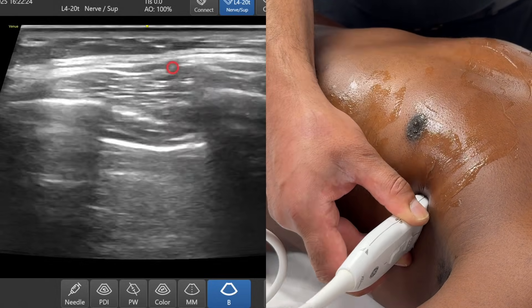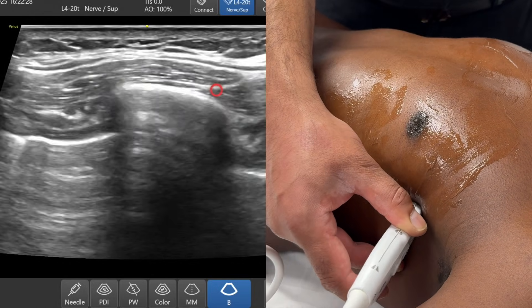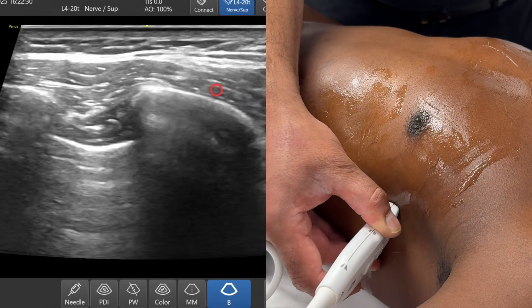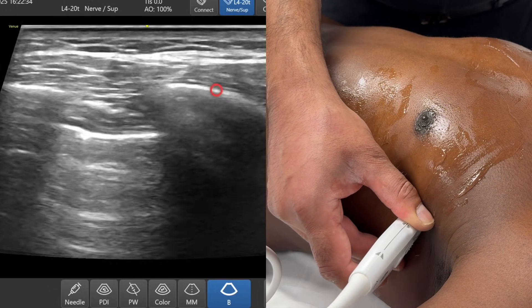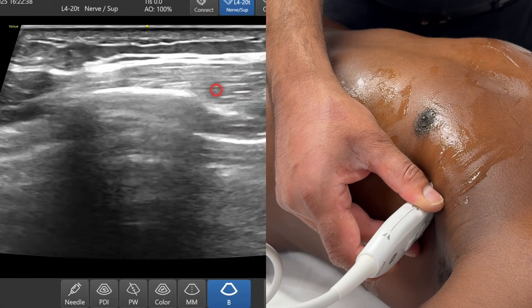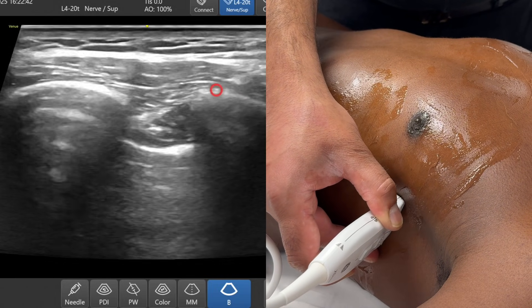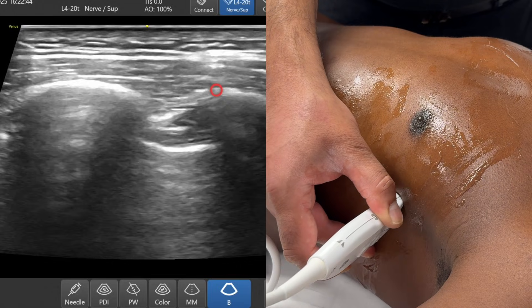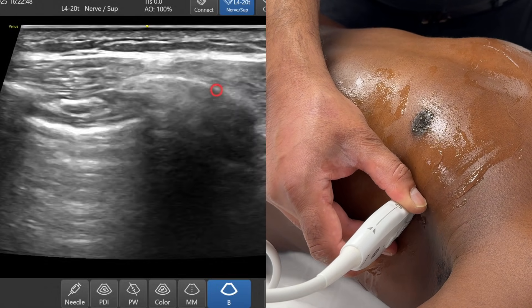That's a superficial serratus anterior plane block. If I go deep to that — deep to the muscle, between the serratus anterior and the ribs — that's a deep serratus anterior plane. You can see it's actually quite easy to find that plane and it's relatively constant. I like to perform deep serratus anterior plane blocks. As I'm sliding up and down, the marker is nicely staying in that space in the deep serratus anterior plane. Many thanks.